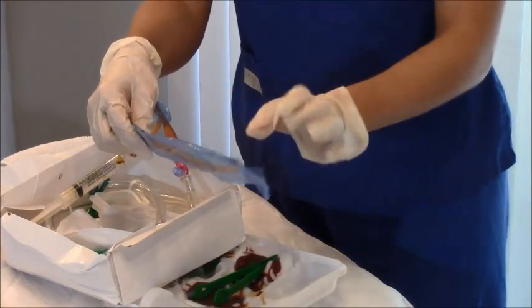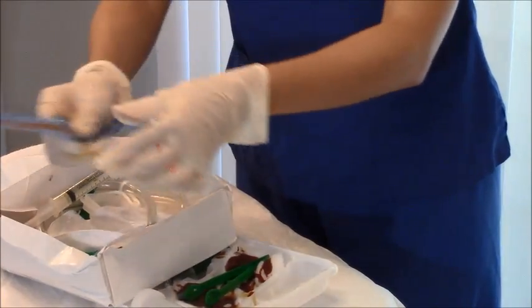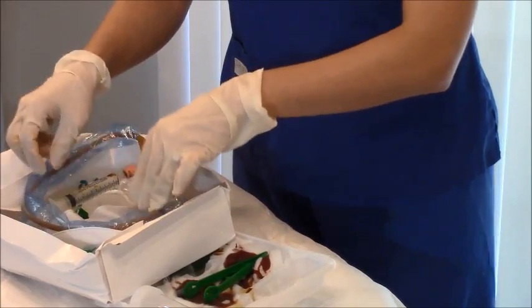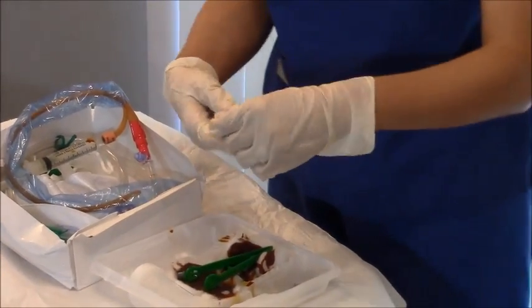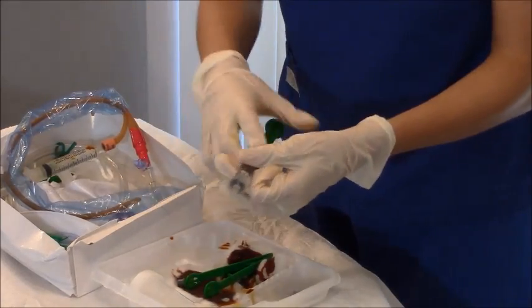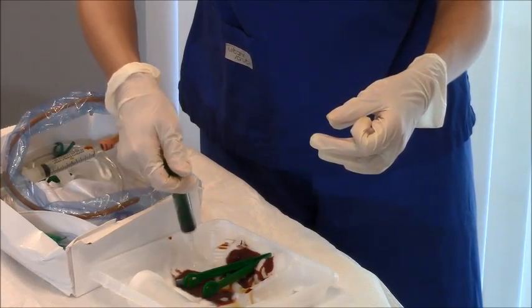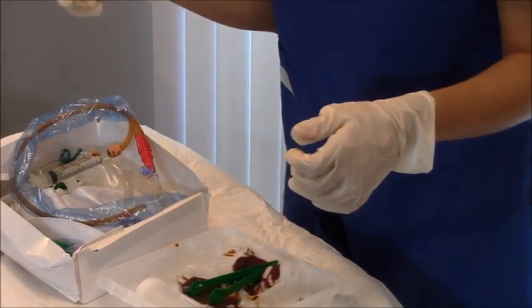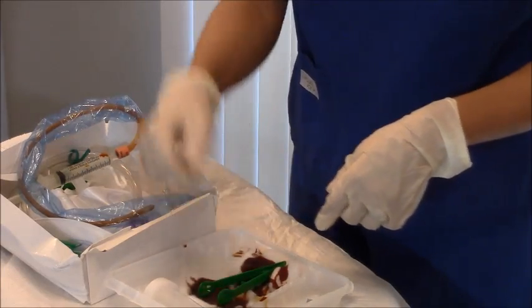I like to keep the protective cover on the catheter until right before insertion, because the catheter tends to move and can slide off the sterile field. The cover also acts as an extra barrier against contamination. For the lubricant, it comes in a pre-filled syringe or a small tear-off container — just squirt it into your tray and discard the packaging. Now you have betadine on your cotton balls and lubricant ready.